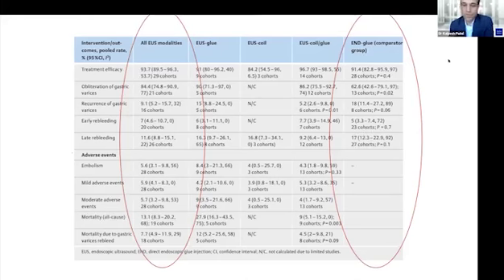And again, what we see here is in terms of obliteration of the varix, a higher percentage in the EUS-guided therapies compared to just glue alone. Part of that has to do with the guidance you get from the EUS itself in terms of Doppler flow and visualization of the varix, a lower rate of recurrence and late rebleeding.